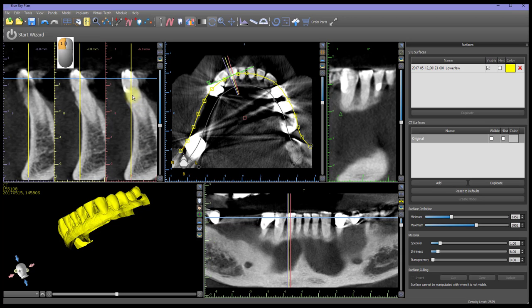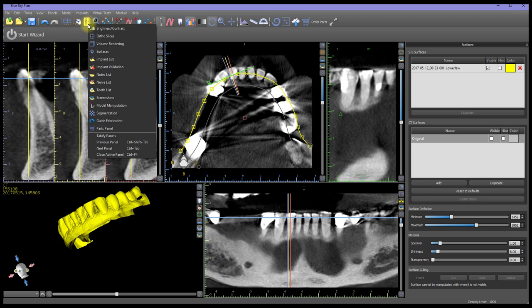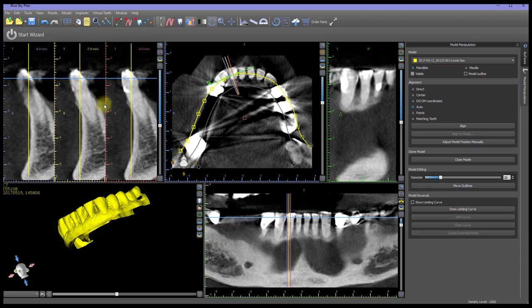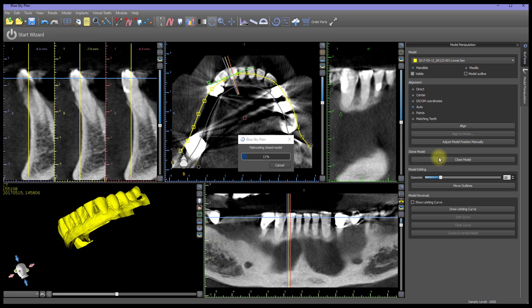To open the panel, left-click on the Panels icon on the toolbar, then left-click on Model Manipulation. In the Model Manipulation panel, left-click on the Close Model button, which is found under the Stone Model heading. The Fabricating Closed Model progress box will show when the closed model is completed.